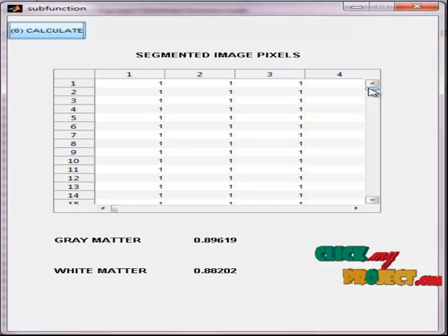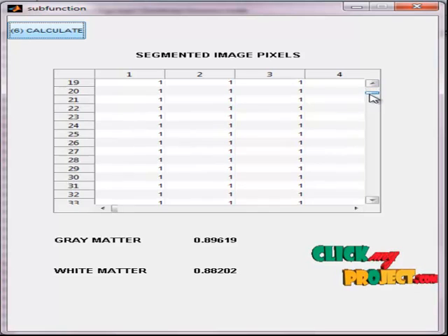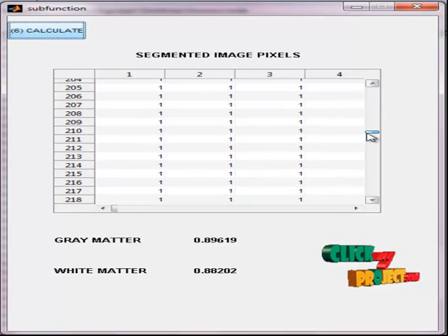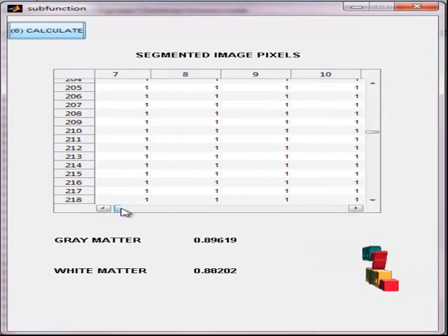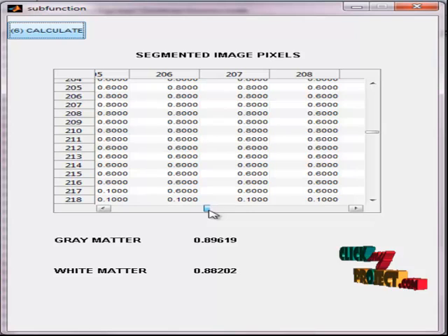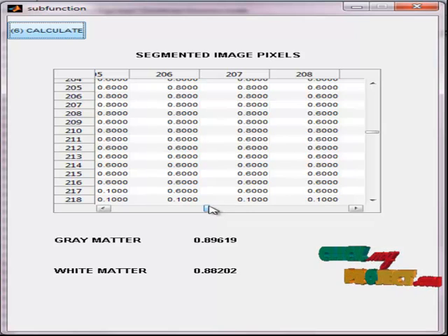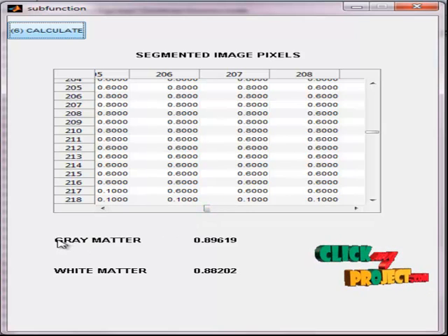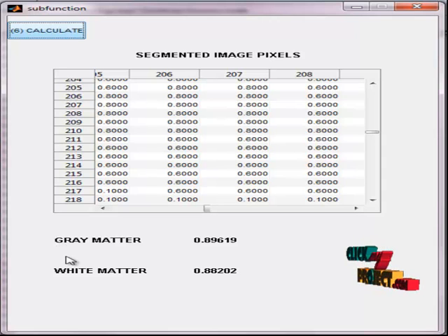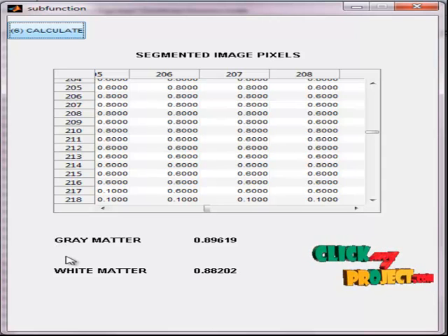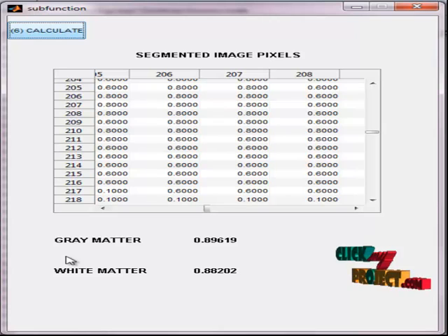The table shows the labels of each pixel in the segmented result. Then, in the text box, we display the gray matter level and white matter level. Thus, we segment the given brain image.